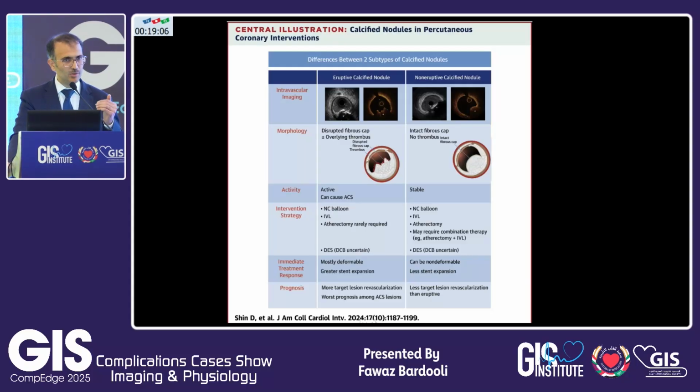And it's going to be problematic because modifying the nodule in general, we don't have a consensus for that. So some people will say orbital atherectomy is fantastic. The others will say rota is better, or IVL. We don't have a consensus. You do what you can to modify it. But the message I want you to remember, if you can leave the nodule alone and fix the artery, that's the best, because most restenosis happens at the nodule site.